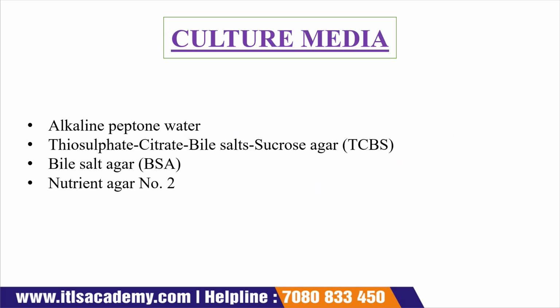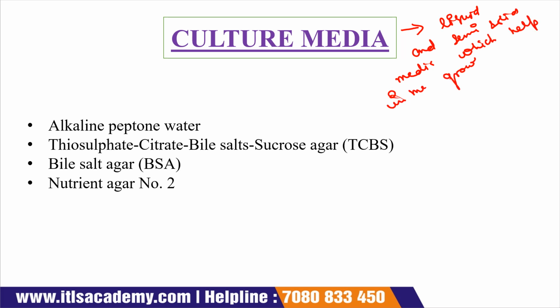Okay, now the next is about the culture media. We all know that culture media is a liquid or semi-solid media which helps in the growth of microorganisms. Here we are using different types of media. Thiosulfate citrate bile salt sucrose agar and bile salt agar are specially used for the growth of Vibrio cholerae.